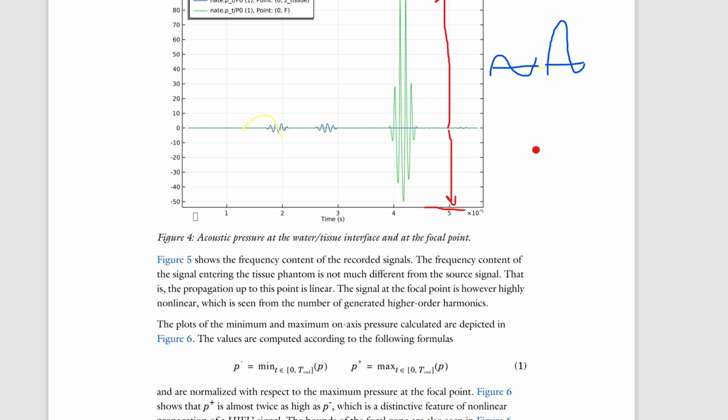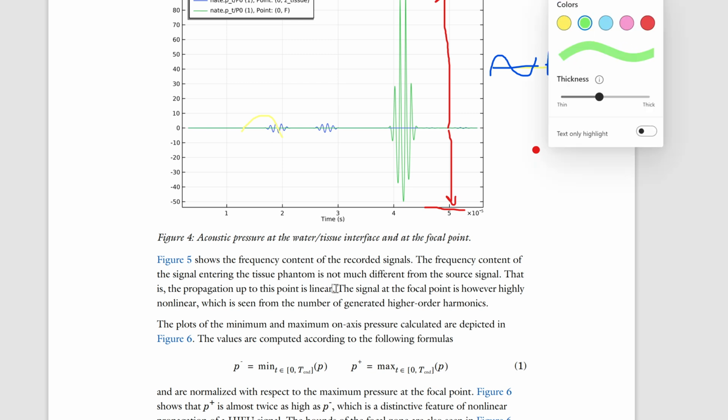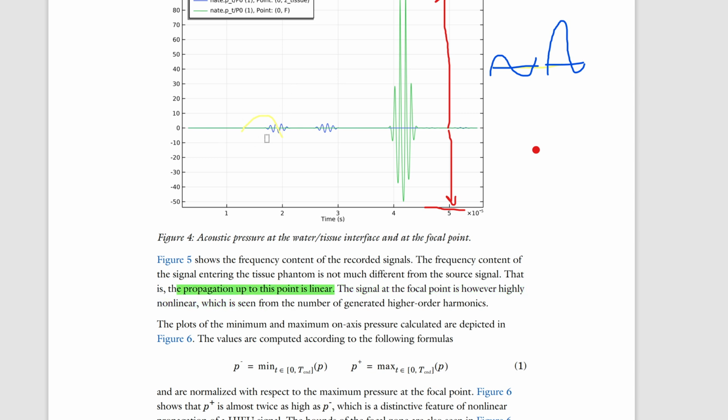Figure 5 shows the frequency content of the recorded signals. The frequency content of the signal entering the tissue phantom is not much different from the source signal. That is, the propagation up to this point is linear. Okay, let's read this again. The frequency content of the signal entering the tissue phantom, frequency content, okay, it's not much different from the source signal. That is, the propagation up to this point is linear. Okay, I can give this a green. Yes, it is linear. Very linear right here. You're seeing this.